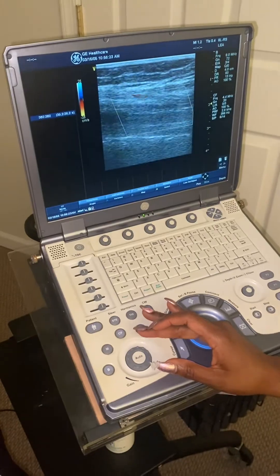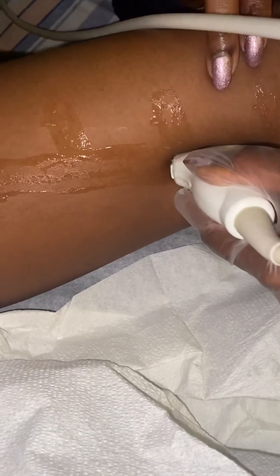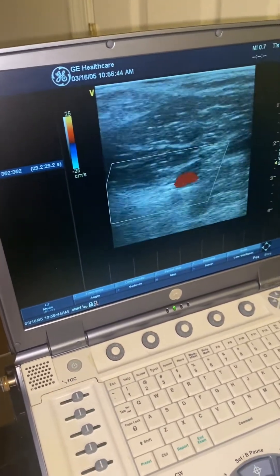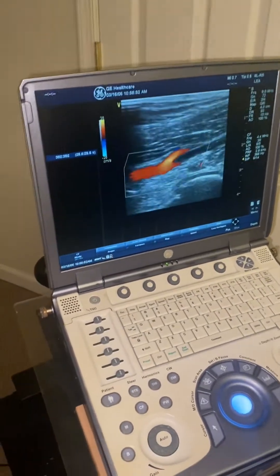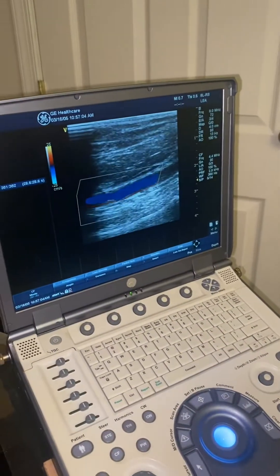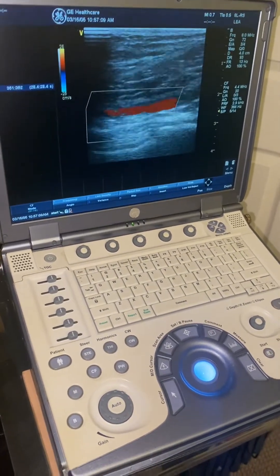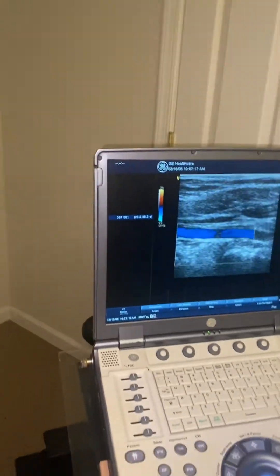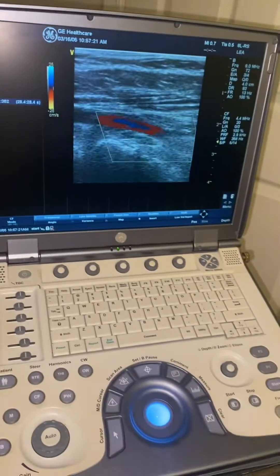When you get to this part of the leg, as I stated in the venous video, you can come right to behind the knee. The popliteal is right at the center behind the knee, and I'm going to stay right in there. I'm rocking the probe towards the head, and right at this segment I can get a proximal popliteal — or some people would call it a distal femoral artery. Then I'm going to rock it to get a proximal popliteal artery. At this point I'm not doing much movement; I'm literally just rocking my probe. Then I steer my box, and now I can get the distal popliteal.